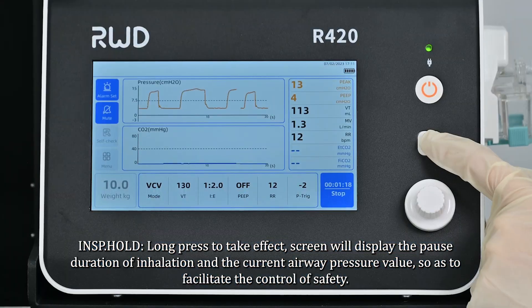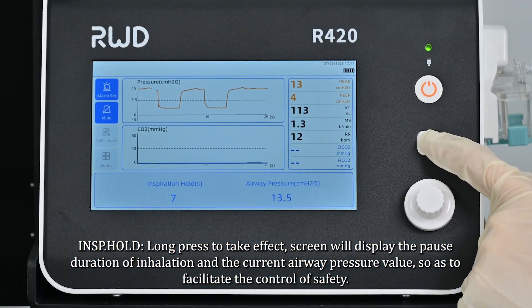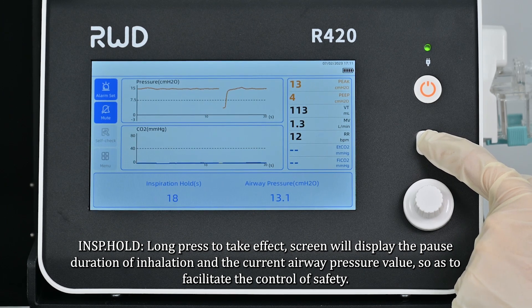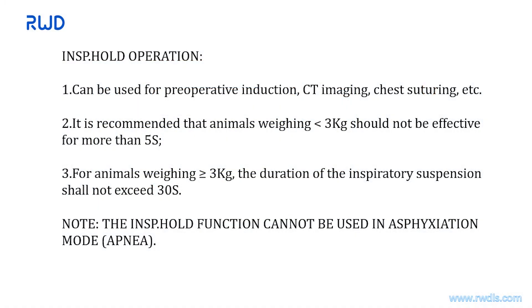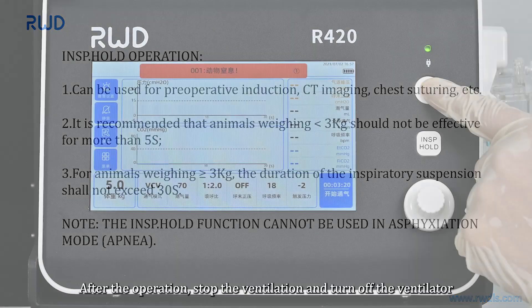Long press to activate the INSP hold function. The screen will display the pause duration of inhalation and the current airway pressure value to facilitate safety control. INSP hold can be used for preoperative induction, CT imaging, chest suturing, etc. Animals weighing less than 3 kg should not exceed 5 seconds; animals weighing more than 3 kg should not exceed 30 seconds. Note: the INSP hold function cannot be used in apnea mode.